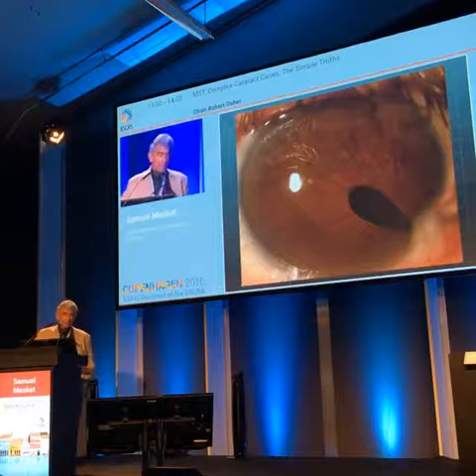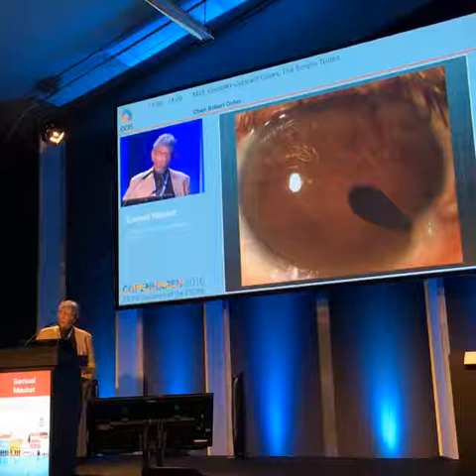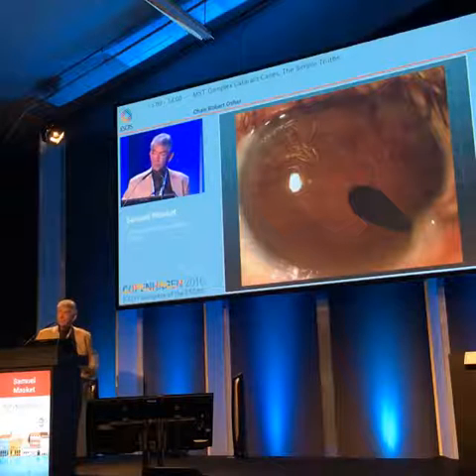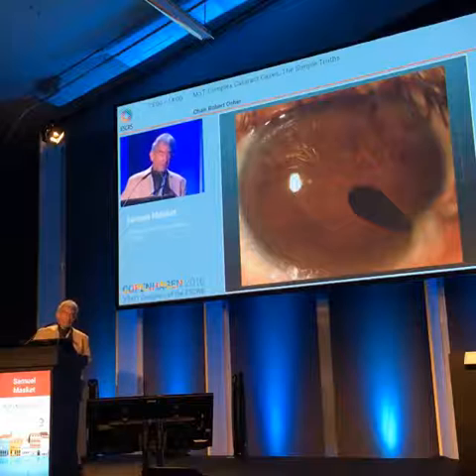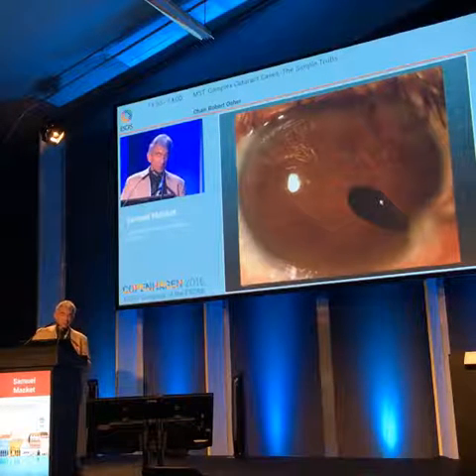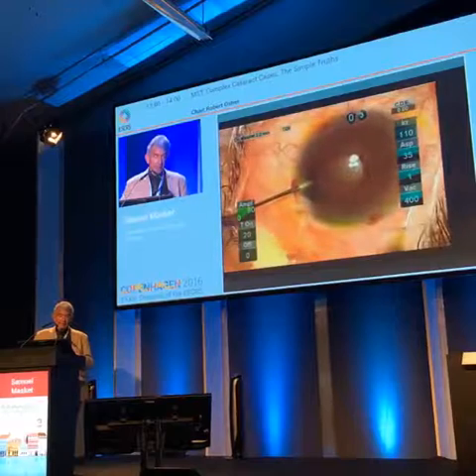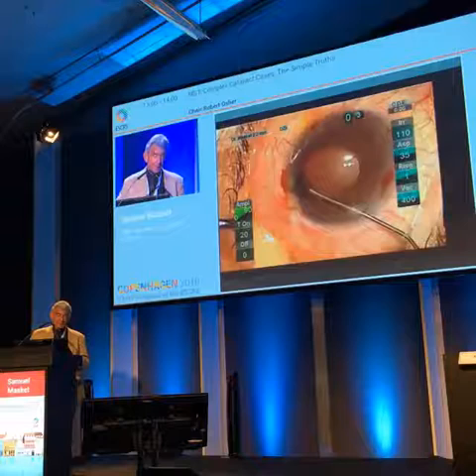And here's a patient who had, more than 20 years earlier, an industrial injury with a perforating injury on the limbus around 4 o'clock. And he has this pupil pulled into this area. He's actually been very happy with his life and with his vision until a central nuclear cataract increases glare and reduces visual function. And here at surgery, we're marking the size of the capsulotomy we'd like to make. But note the pupil. Now the pupil is eccentric and it doesn't have an intact sphincter.